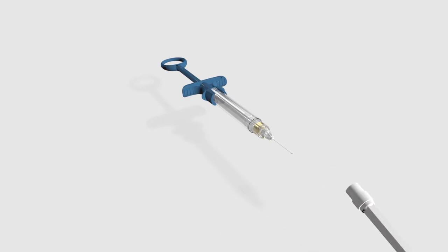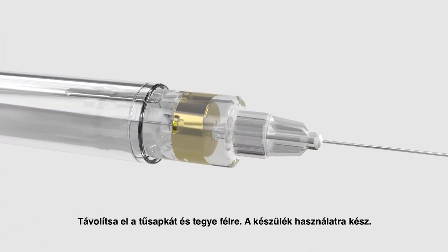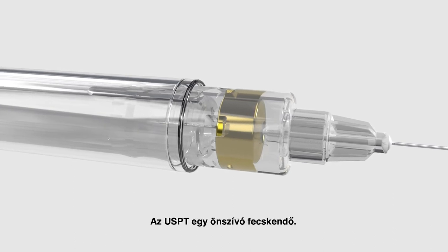Step 5: remove the needle cap and discard it. The device is now ready to use. The Ultra Safety Plus Twist is a self-aspirating syringe.